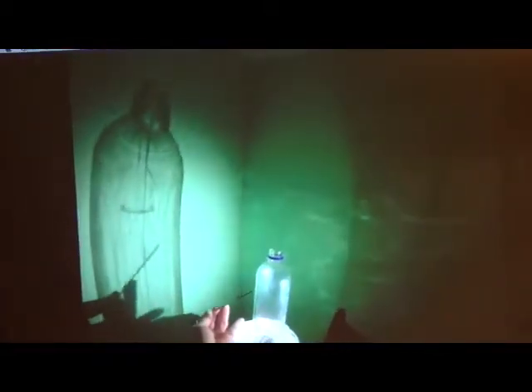Now we're going to go through three different situations. Situation number one, my needle approaching the midline. Number two, it goes away from the midline on the side of needle placement. And situation number three, it goes away from the midline on the opposite side. Let's see what happens. With the needle approaching the midline and positioning the light for a straight lateral view, you can see the needle tip touching the middle line or the edge of the shadow. When I go for the contralateral oblique view, I can see my needle deep inside the shadow.